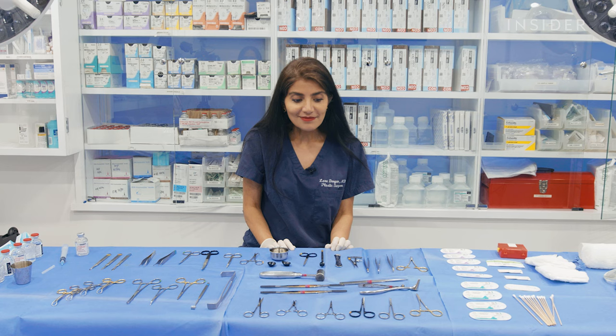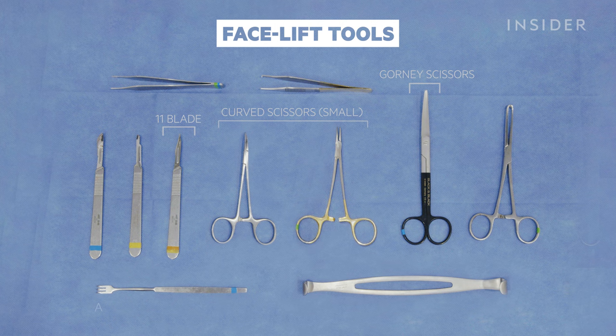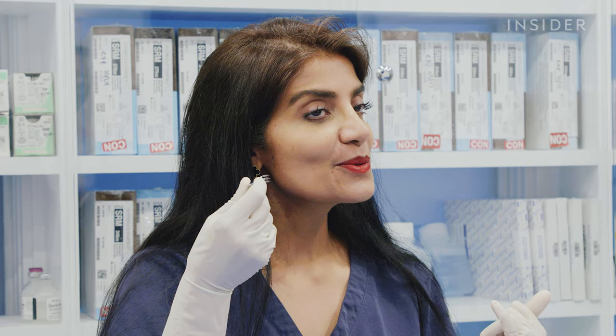What is the tiny rake for? The tiny rake? Yeah. It's called a rake, actually, or usually a Senn more formally. So this little retractor is often used in a facelift to lift up tissue planes to allow for better visualization.